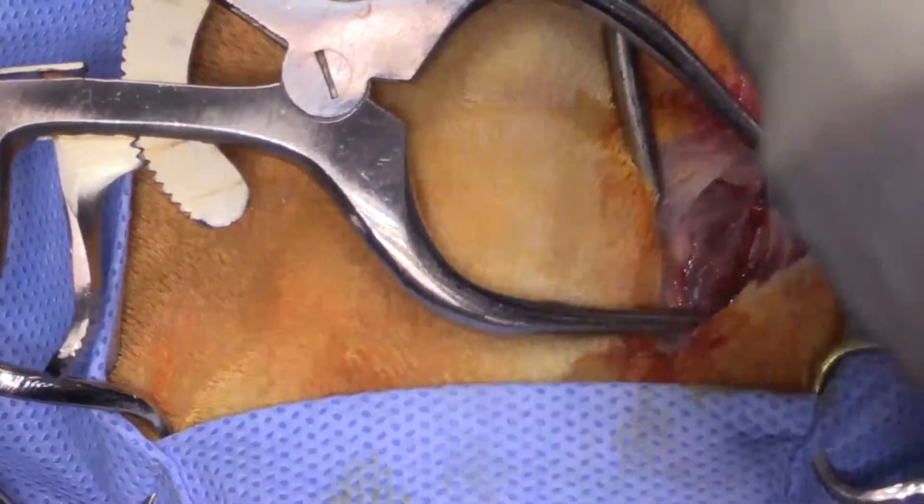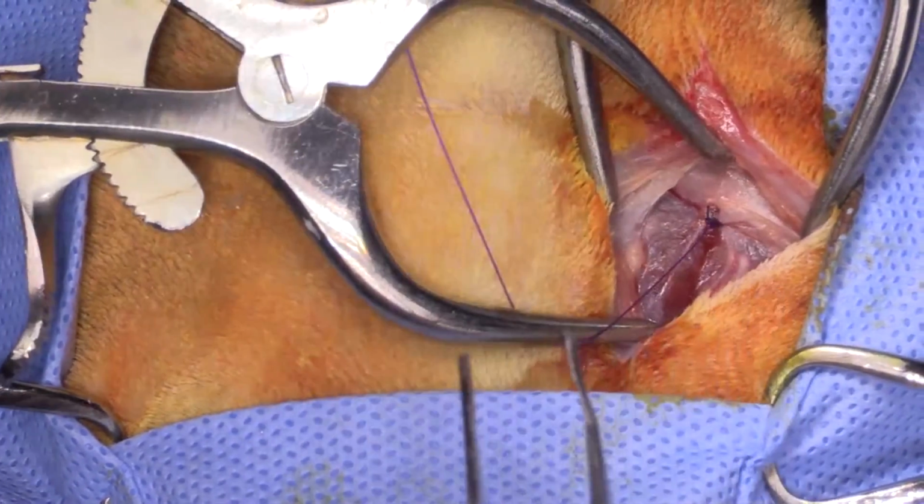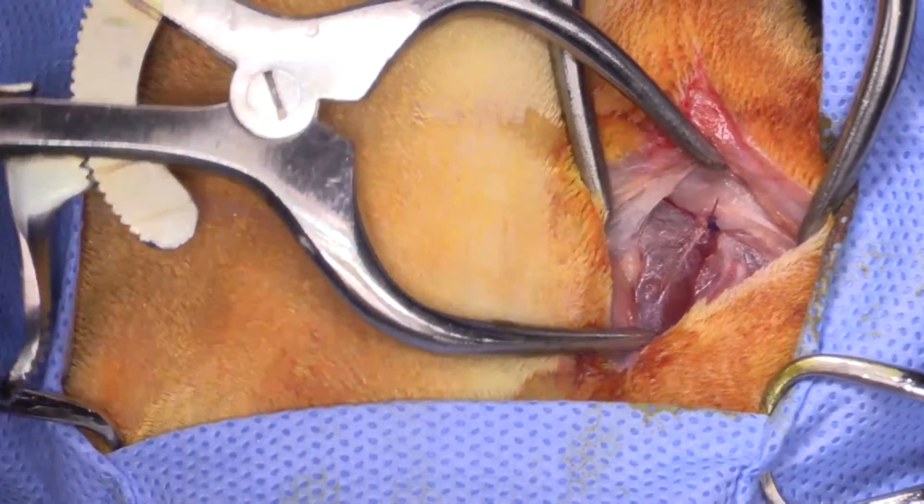Get you to run this suture for me, please, Ed. I think you've gone underneath the Gelpi. Yep.